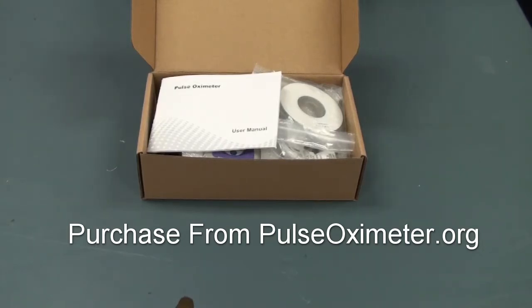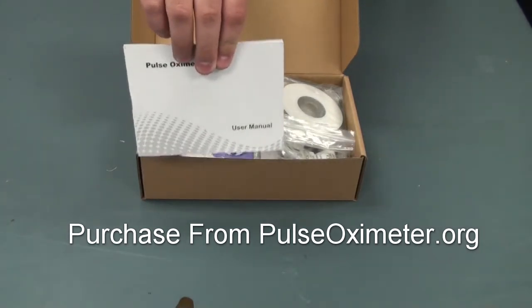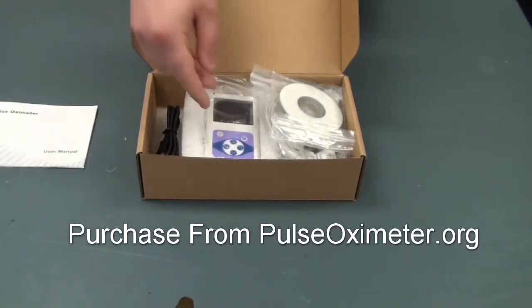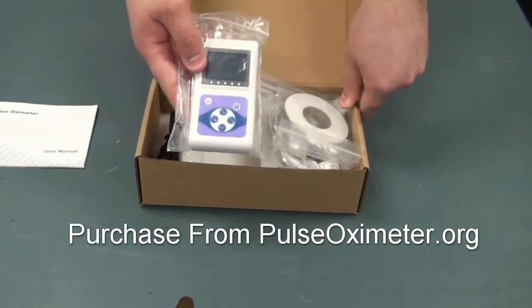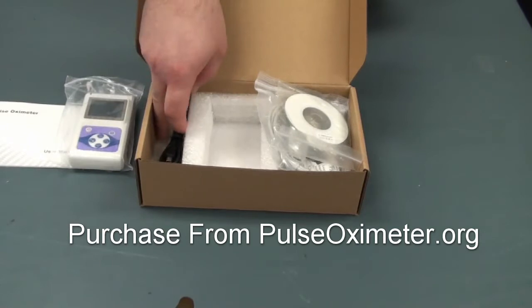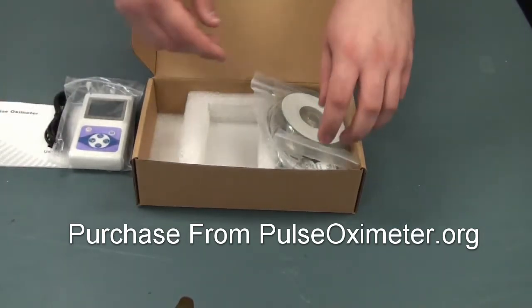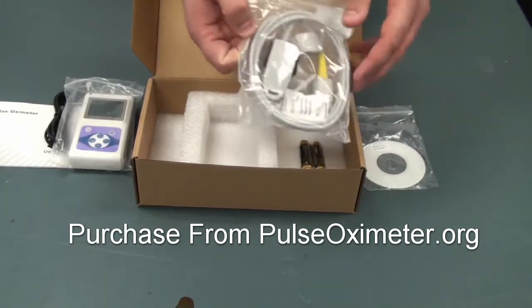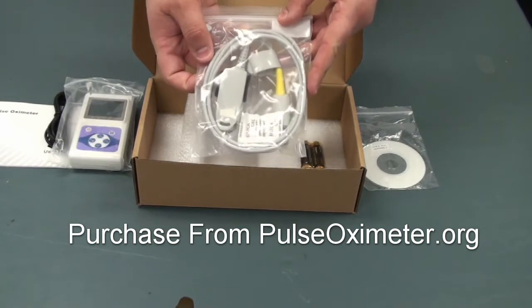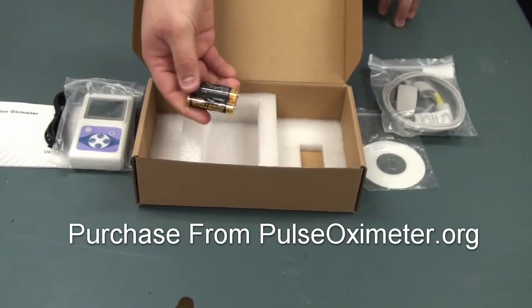Hello and welcome to the unboxing of the CMS-60D. Included will be an instruction manual, the device itself, a transfer cable, the software CD, the probe that you choose to come with the device, and a pair of AA batteries.